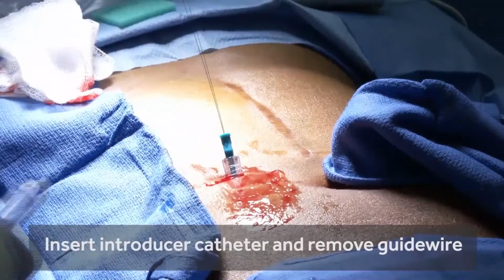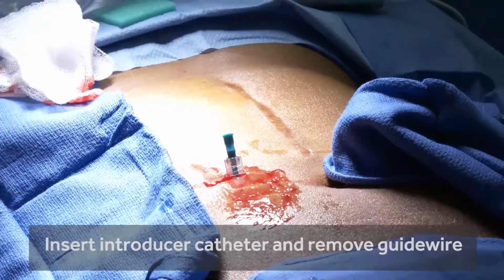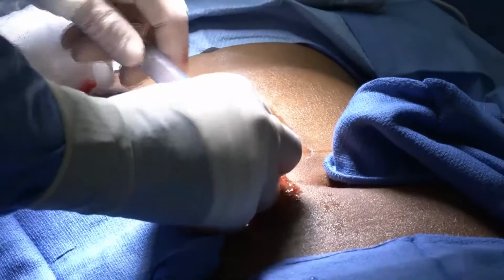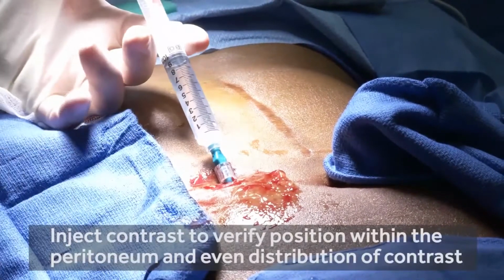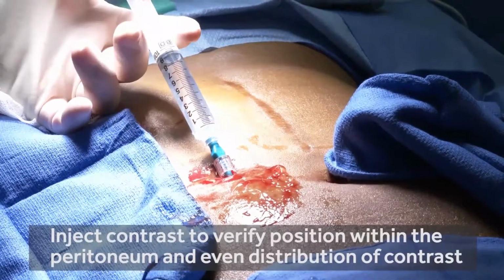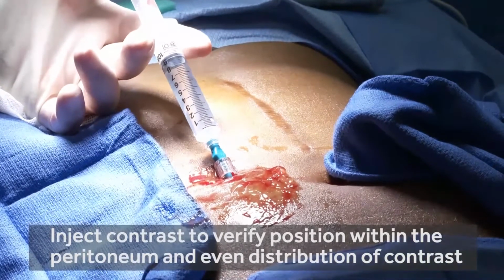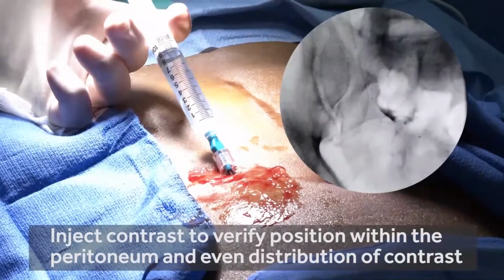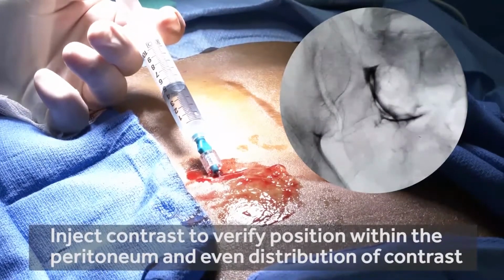Unless there's abdominal pathology or the small bowel adheres to the anterior abdominal wall, it's very difficult to actually puncture into the small bowel. And if the wire goes easily, you'll get this type of picture when you inject that small inner stylet. And you can see contrast now is going to outline the loops of bowel.